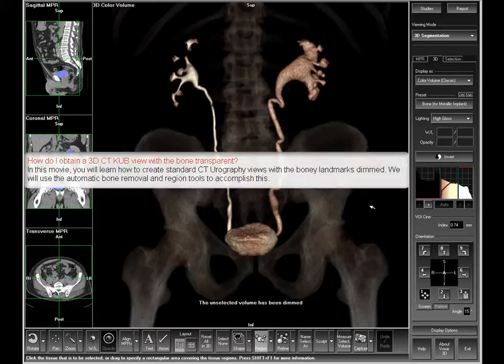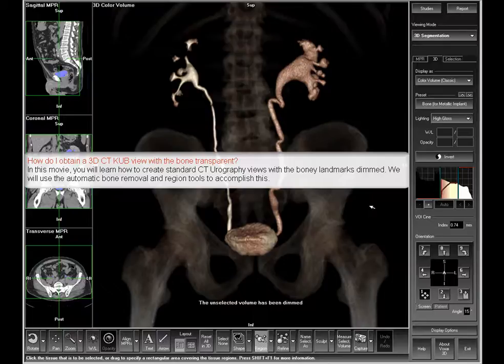How do I obtain a 3D CT KUB view with a bone transparent? In this movie, you will learn how to create standard CT urography views with the bony landmarks dimmed. We'll use the automatic bone removal and region tools to accomplish this.